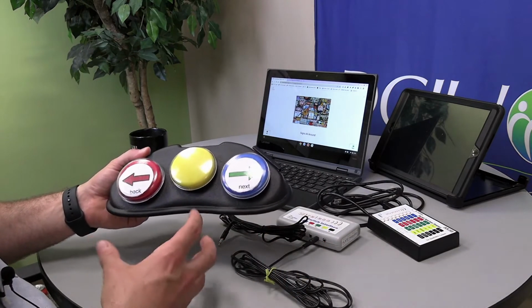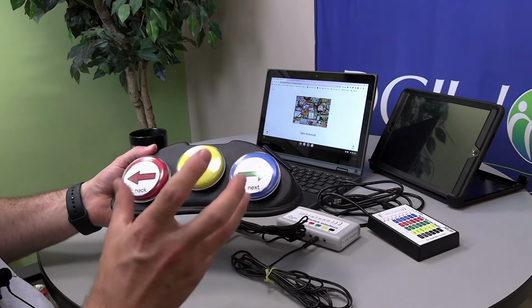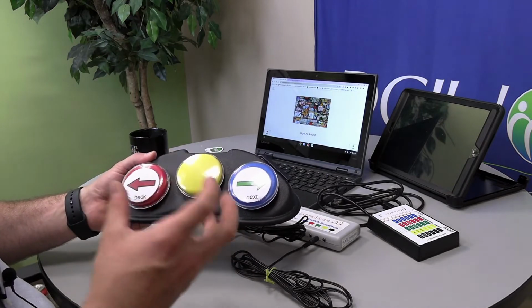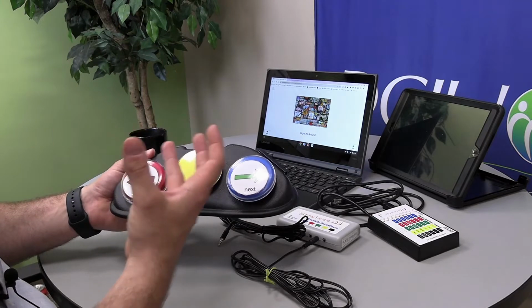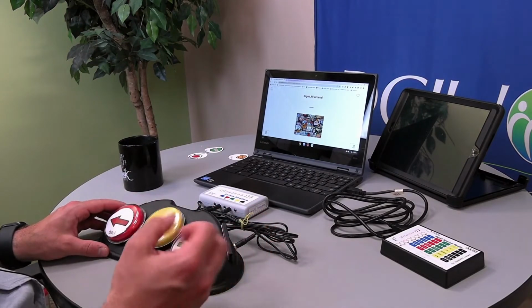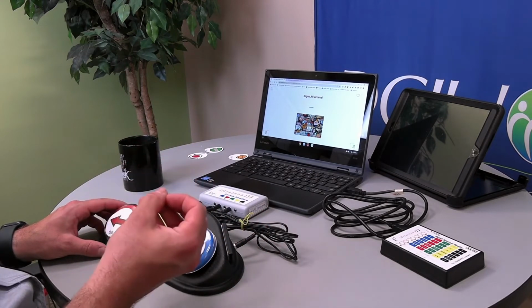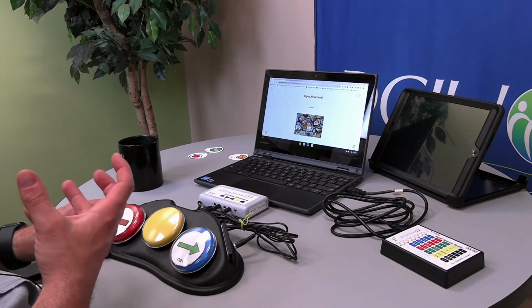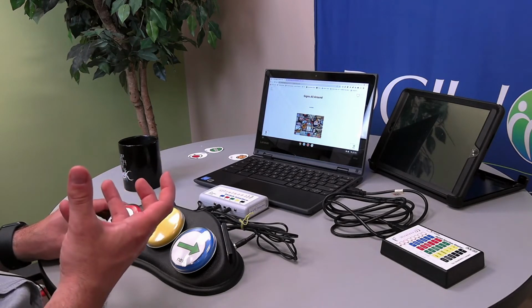But again, we want to really reinforce the idea of core vocabulary, not just for the student's vocal output or communication, but also because it pairs nicely with the activity and it really reinforces what that student is accessing at that time. All right, so the first activity we want to highlight with Switch Access is a website called TarHeel Reader. We did focus on this in our previous video as a way to create simple books for students to access. And I believe we did mention that this website is already Switch enabled or accessible.